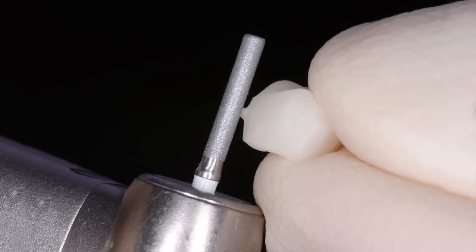The sprue should be removed from the Enamic crown by using cut-off discs or stones as normal. To condition the surfaces to be characterized of the Enamic restoration, the surfaces need to be free from grease to optimize the wetting and retentive bond of the stain. The surfaces do not need to be polished prior.